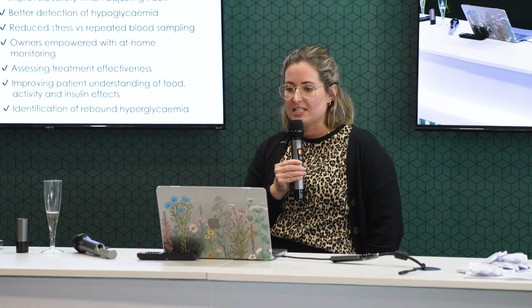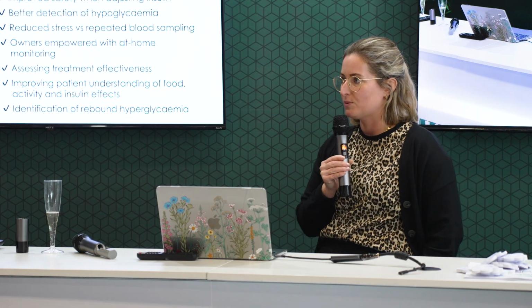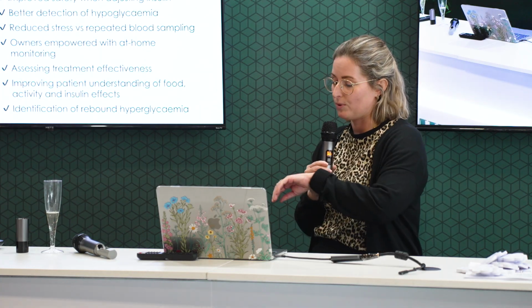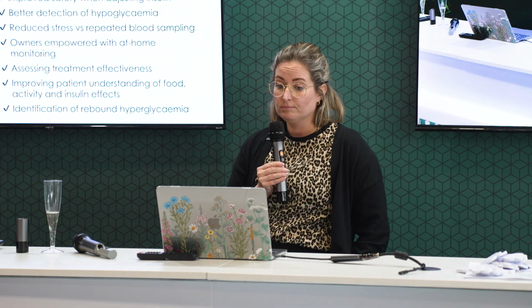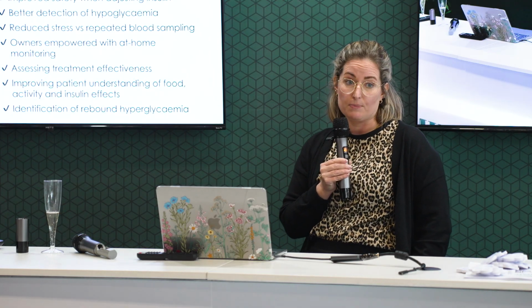Now, in terms of benefits to veterinary diabetic care, I think there are lots of benefits that we can see specifically in this group of patients. So hopefully it's going to improve safety as we're adjusting our insulin. That might be as we're getting these patients stabilized shortly after diagnosis, or perhaps if we're thinking about dose changing. We're going to have better detection of any low episodes that the patient might have.